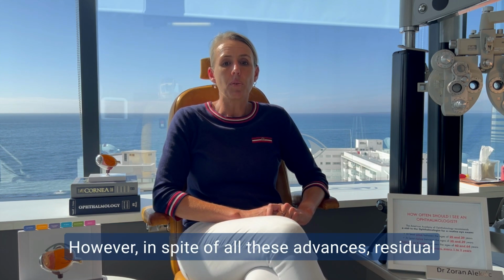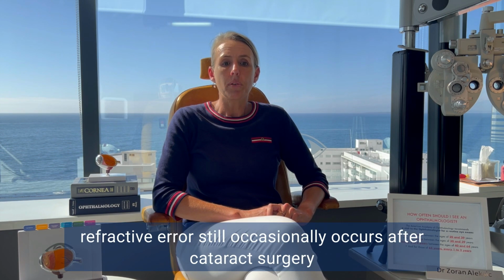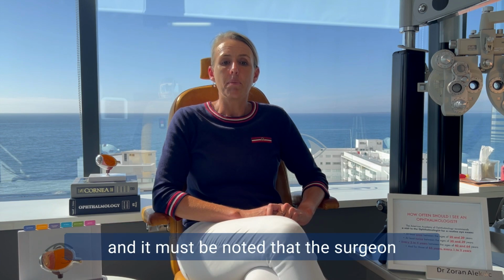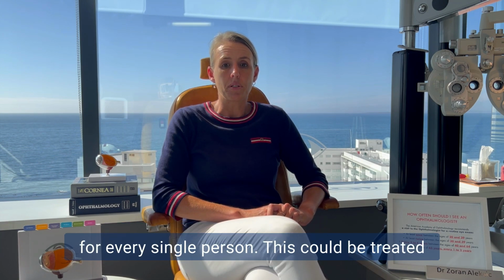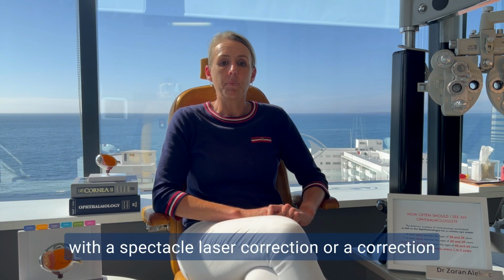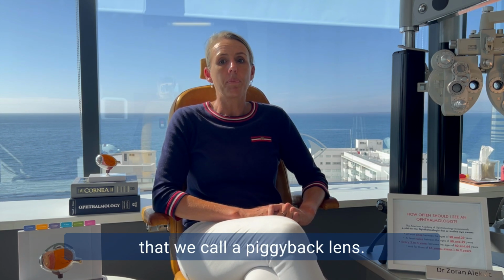However, in spite of all these advances, residual refractive error still occasionally occurs after cataract surgery, and it must be noted that the surgeon cannot predict the visual outcome of his operation for every single person. This could be treated with a spectacle, laser correction, or a correction that we call a piggyback lens.